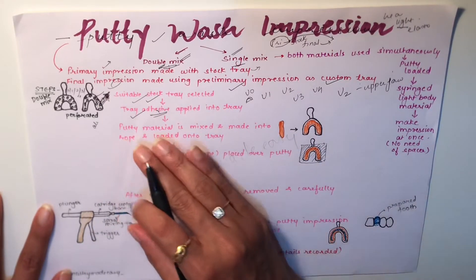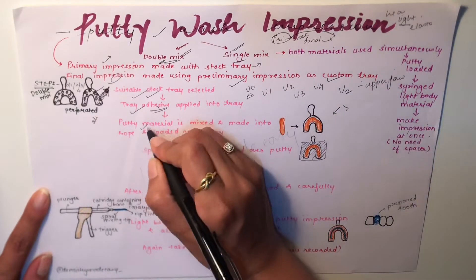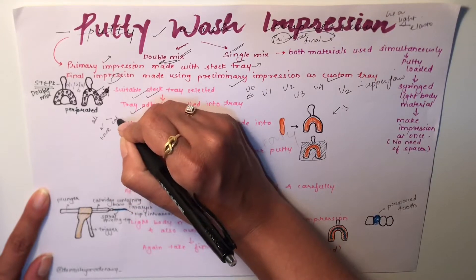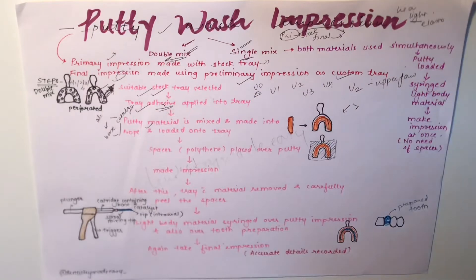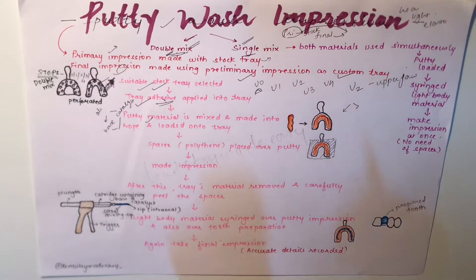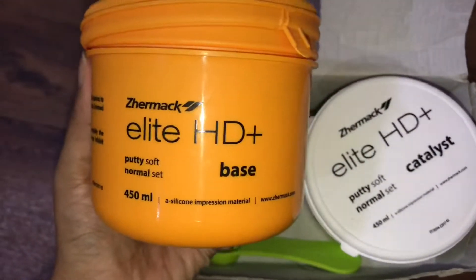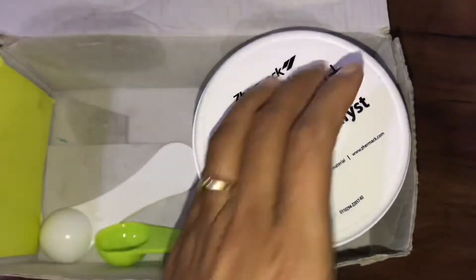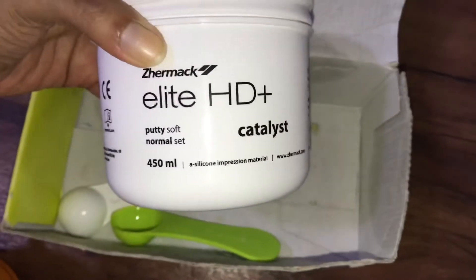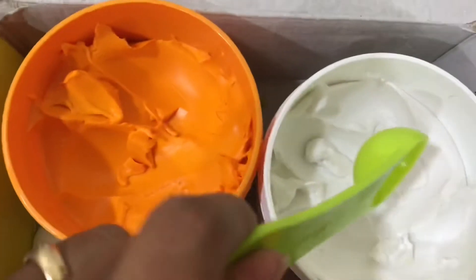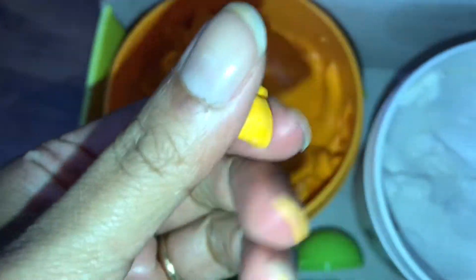Next, mix the putty material. It is available as a base and a catalyst. Take equal amounts of both and mix them together, forming a rope shape, then load it onto the selected tray. The catalyst is white and the base is a mango-yellow color. When mixed properly, the material becomes a light yellowish color, indicating it is well and uniformly mixed.